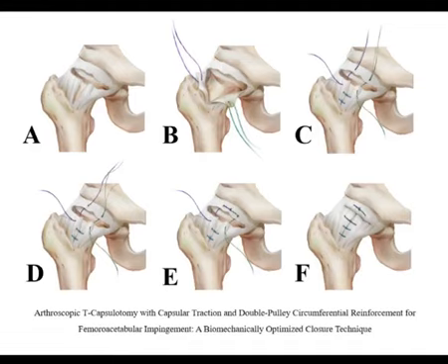Schematic diagrams can help simplify the understanding of this technique's procedure steps.